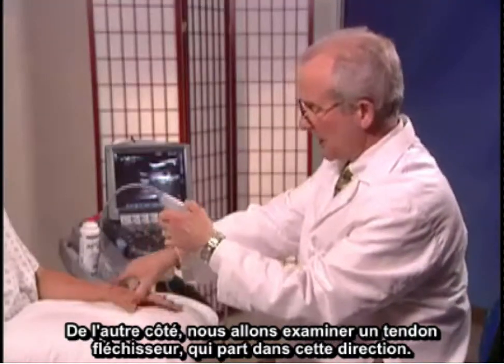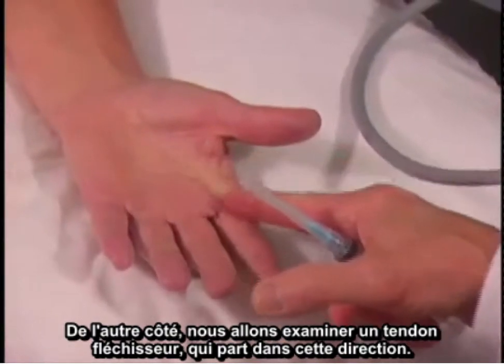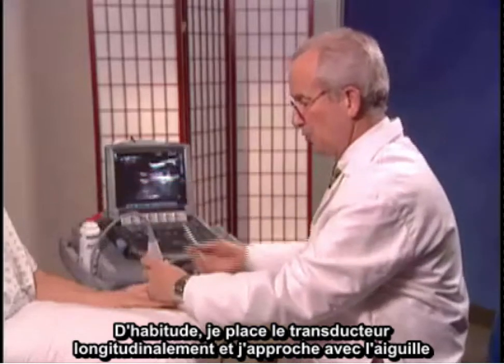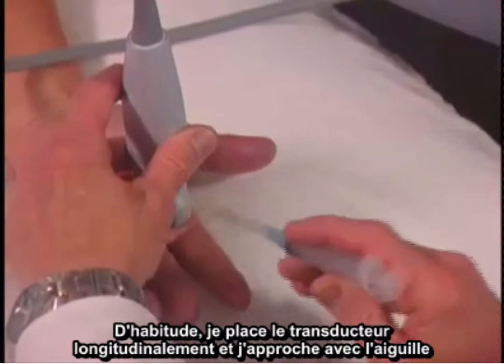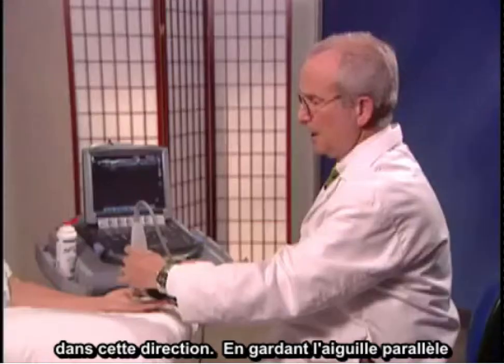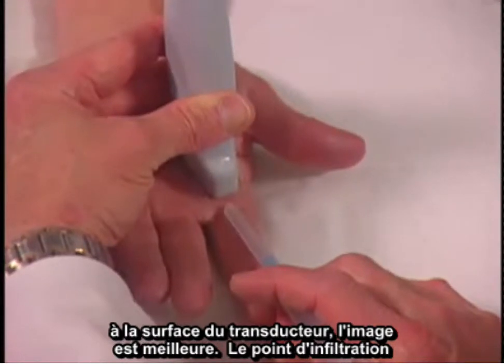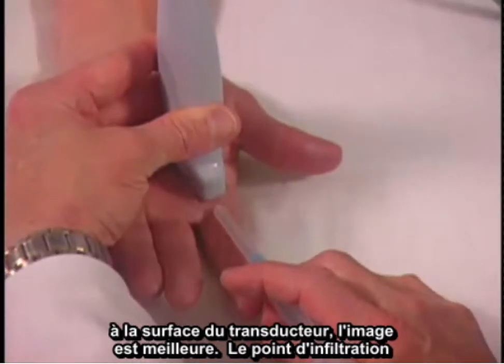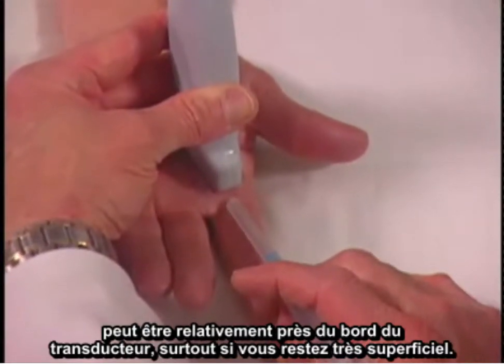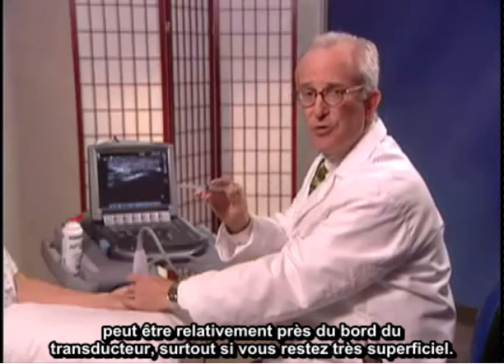On the other side, we'll be looking at a flexor tendon which travels in this direction. I will usually place the transducer longitudinally and approach with the needle in this direction. If you keep the needle parallel to the surface of the transducer, it shows up the best. The insertion point can be quite close to the transducer's edge, especially if you're going very superficially.